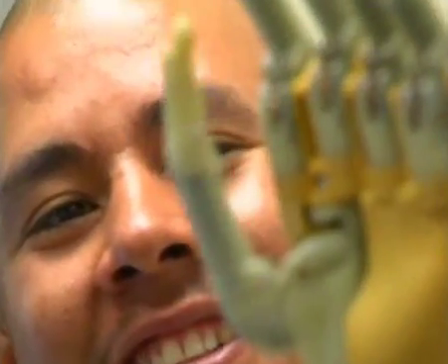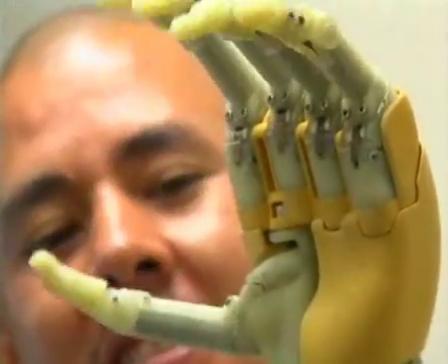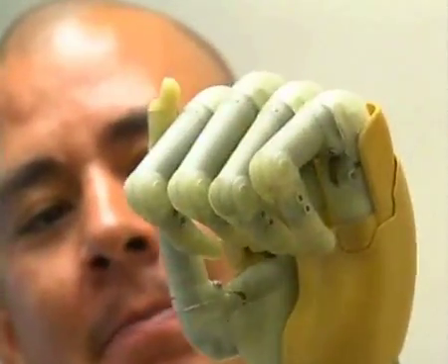For most patients when they have an amputation, the brain still thinks the hand is there, so they can move the hand even though it doesn't exist. The muscles that would normally move the hand still behave the same way as if the hand was there. If you make a big muscle contraction, the muscles actually do that even though the hand is not there, and that's the signal we detect — that muscle contracting in the arm.